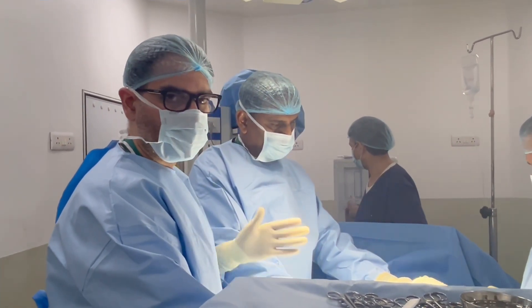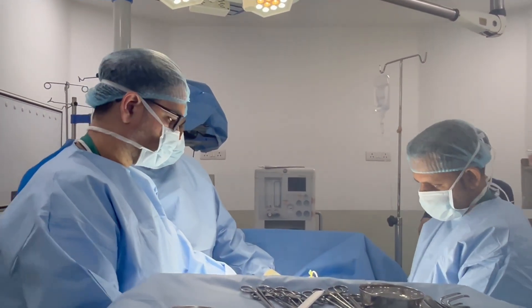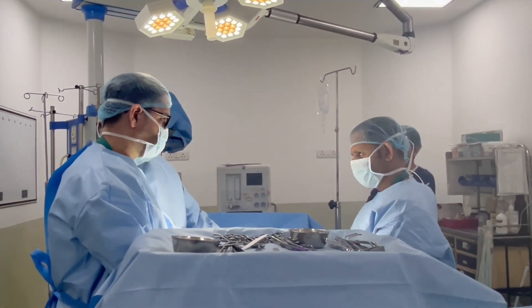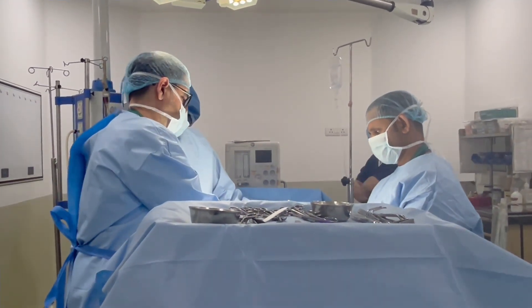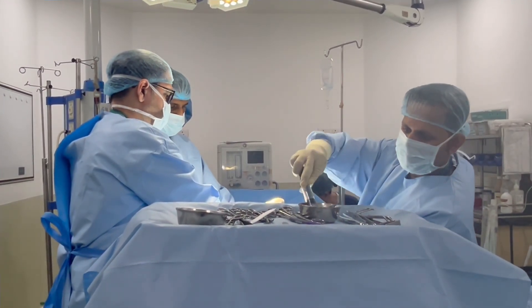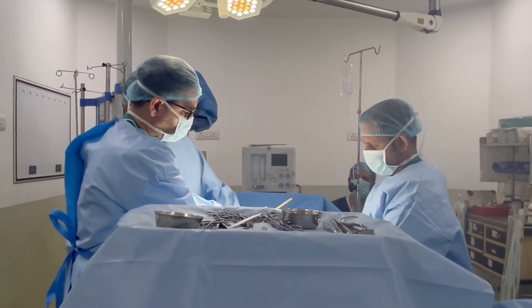The maximum erect length determines the exact size implant, so we apply the same implant. Now there is still artificial erection and the penis is erect. The length is almost 16 cm — that means about 6 inches — and the girth is also good. So we thought we will apply the Tectra implant at 13 mm.